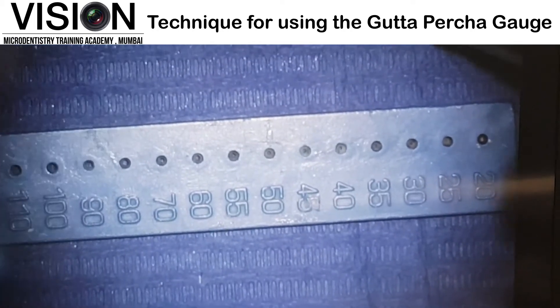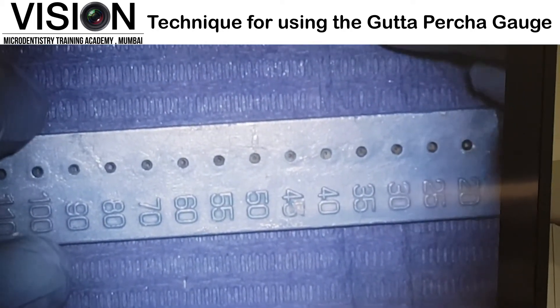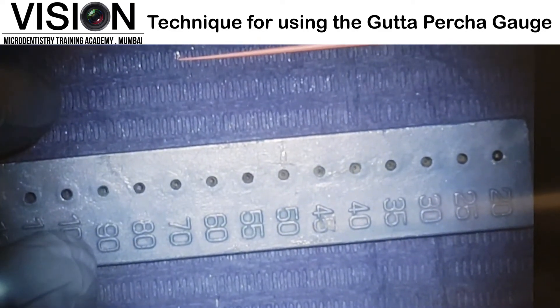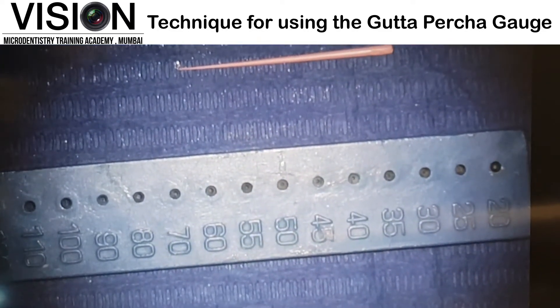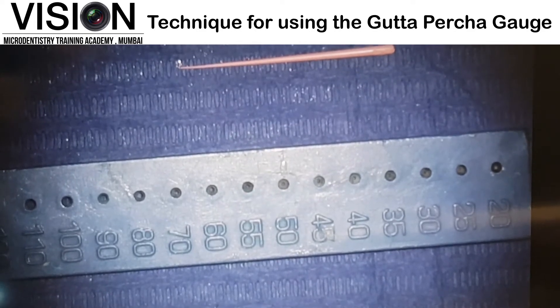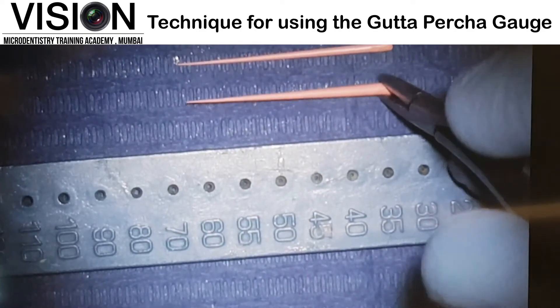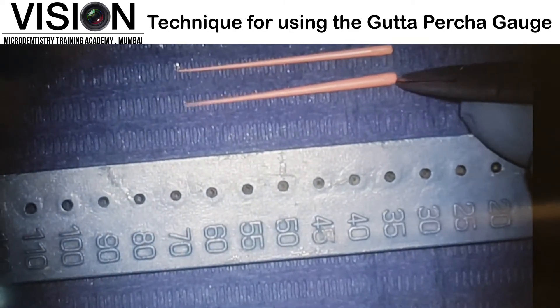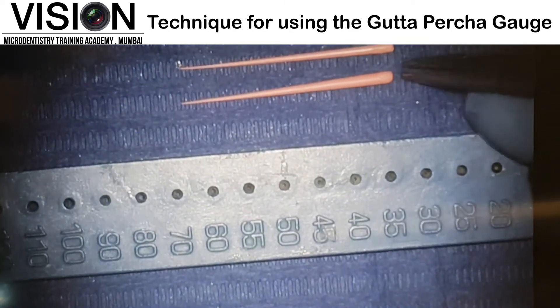Here I have two non-standardized Gutta Percha points. This one is a fine medium and the next one I am going to place is a medium point. You can appreciate the difference in the diameter of the medium as well as the fine medium point.